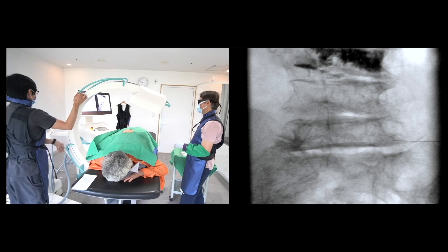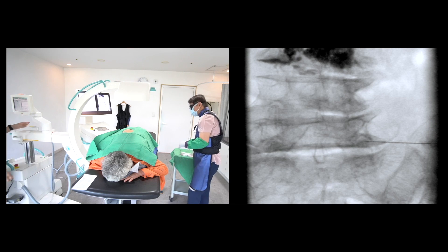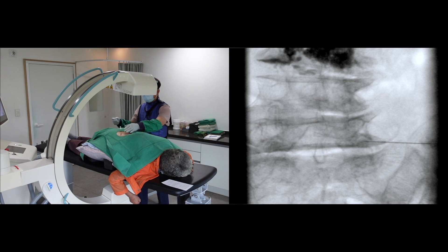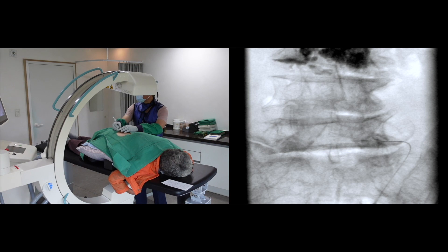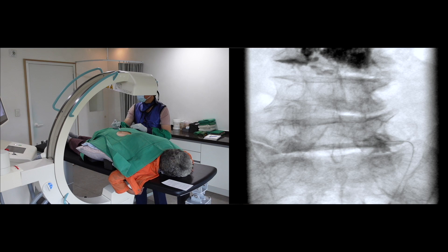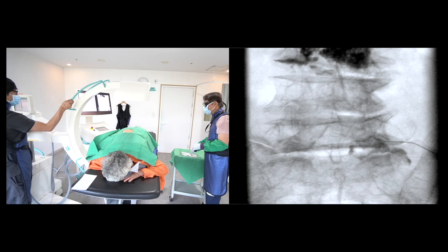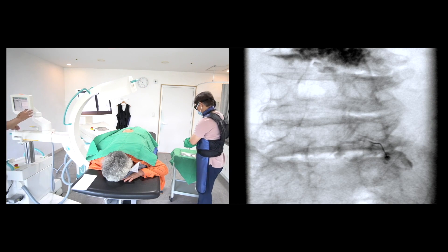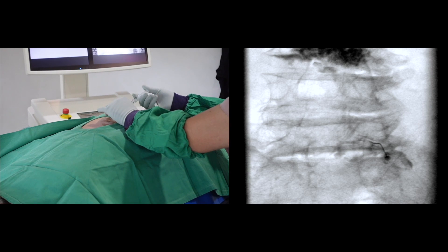Let me show you the contralateral oblique view. Let me confirm with the contrast media. I will advance the needle a little bit. The contrast spread looks good. I will deliver the steroid mixture.